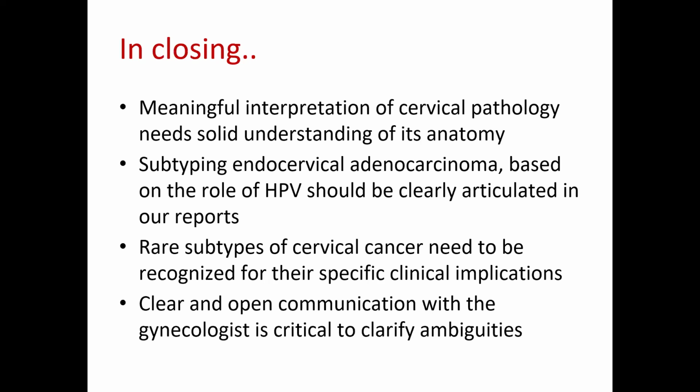So at the end, I hope I was able to highlight to you that meaningful interpretation of cervical pathology needs solid understanding of its anatomy. Go over the anatomy. It is deceptively simple. When you look at the slide, make sure you understand where is the cautery, what is a margin, what is not a margin, where the vagina ends and the cervix begins.